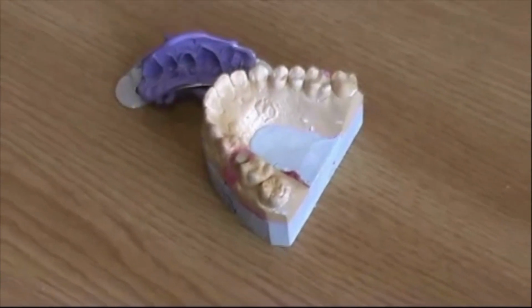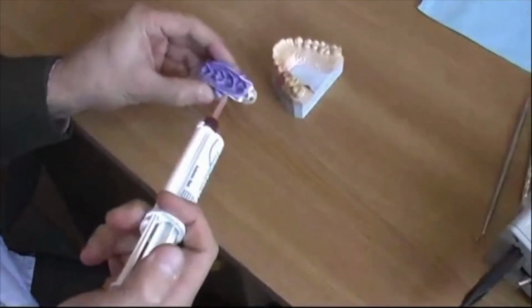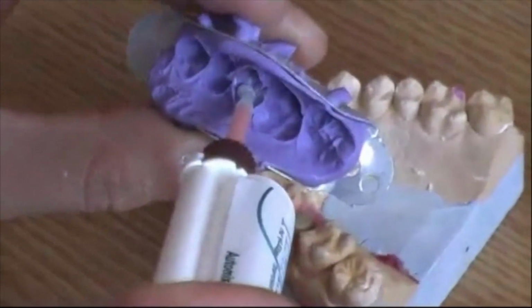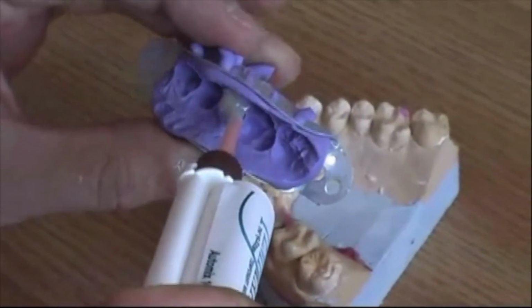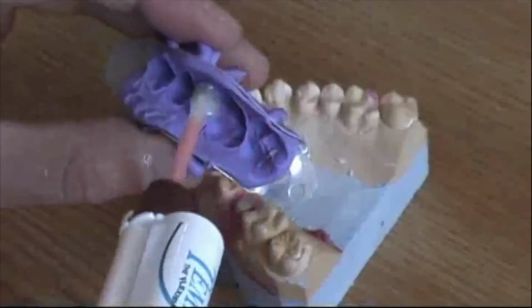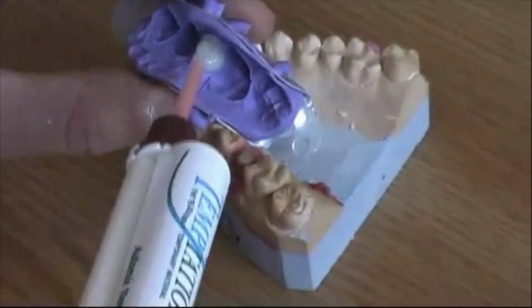Now, you see, we have the index and we have the abutment in the mouth. And we place our resin, we just inject it. That's office-use resin. It's more expensive because dentists have more money than technicians. That's how it goes. They charge patients more and so on. So we can afford such wonderful materials.